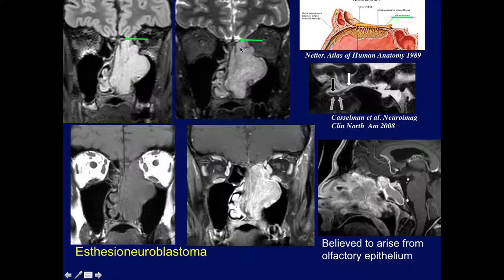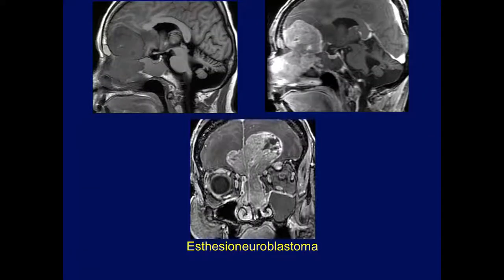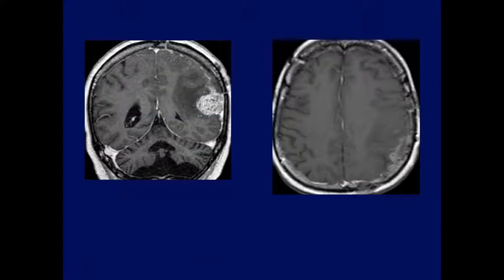Here is another esthesioneuroblastoma. In this case it did not invade the skull, but you can see how close it's getting to the olfactory tracks. These are believed to arise from the olfactory epithelium within the roof of the nasal cavity. And unfortunately, here is a very large esthesioneuroblastoma with tremendous extension into the intracranial cavity.